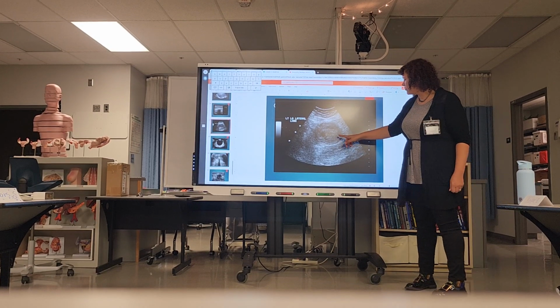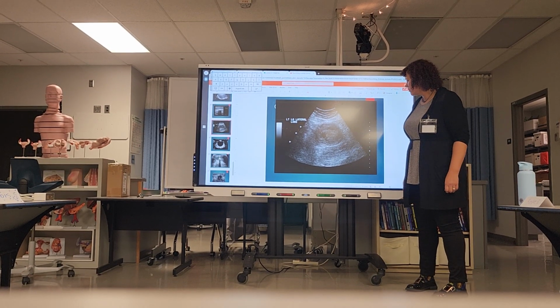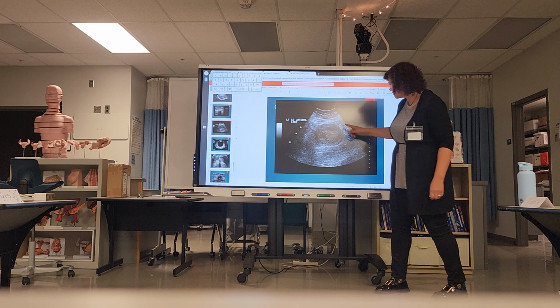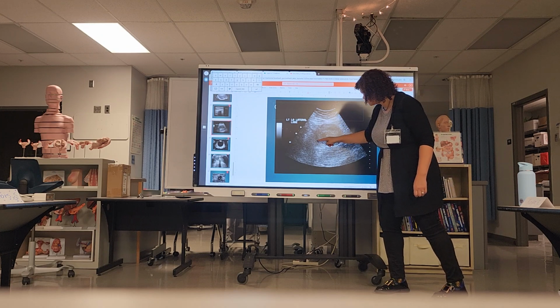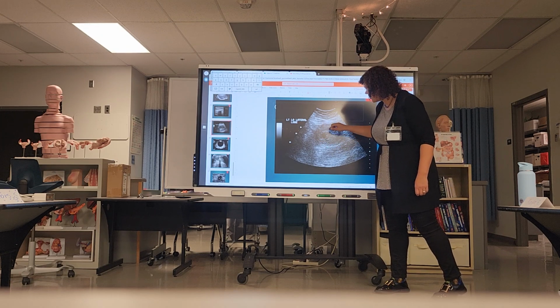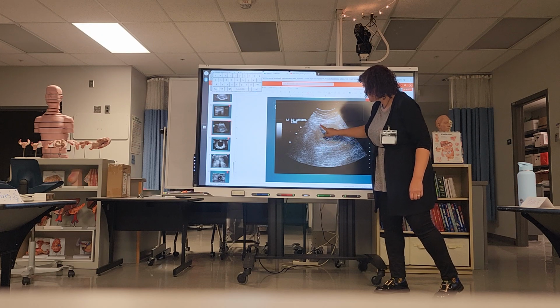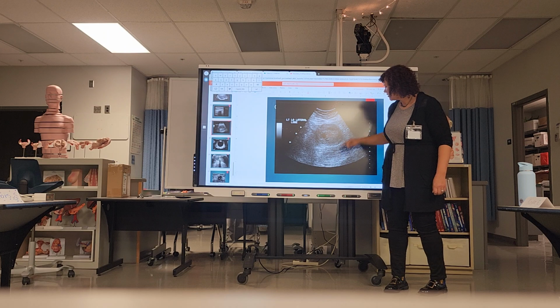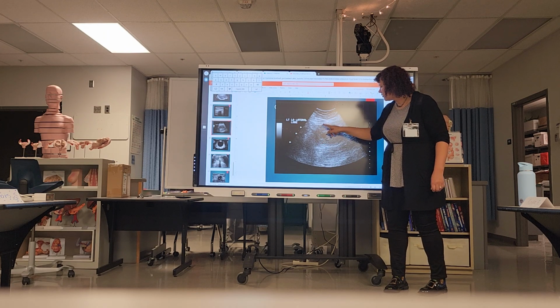Okay, what about the echogenicity here? Hypo, yeah. And what about the borders? Well defined. A little irregular on that side, right? It's a little irregular. It's hard to tell here. Over here, it becomes a little bit isoechoic, right? We can definitely see the posterior border, but it's a little bit irregular.